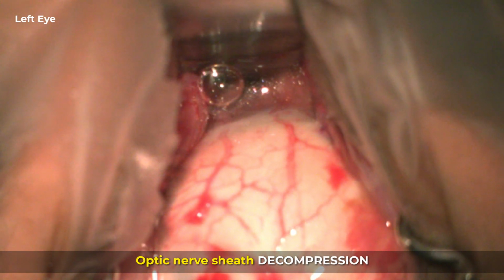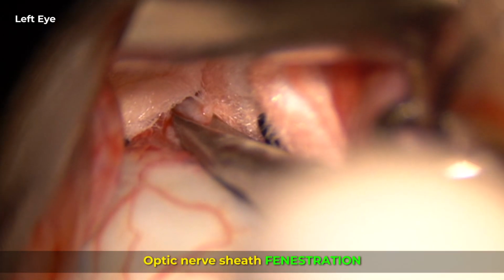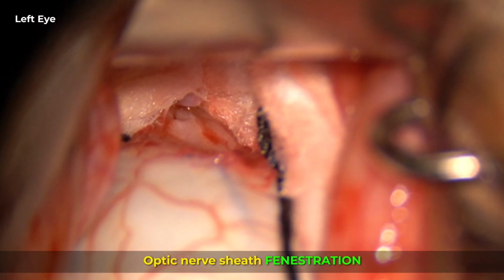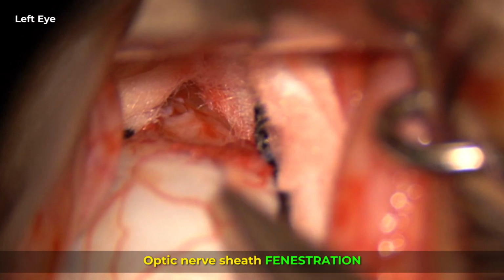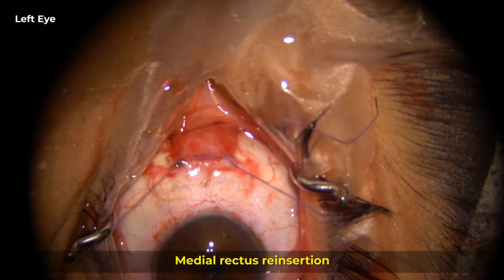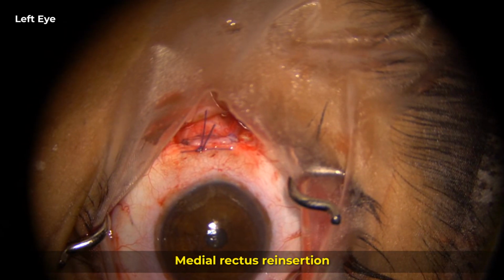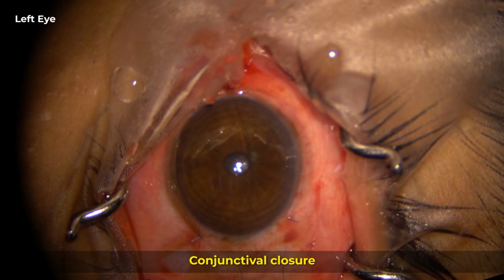Note the gush of fluid. This is the technique of optic nerve sheath decompression. Thereafter, a part of the sheath is removed, performing the optic nerve sheath fenestration. The baseball stitch is then removed. The MR muscle is then sutured back to its insertion and the conjunctiva finally sutured with 8-0 sutures.